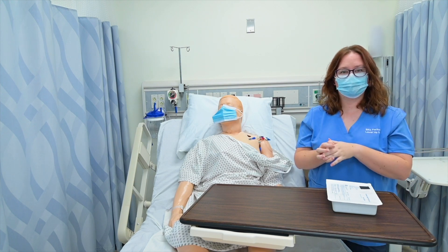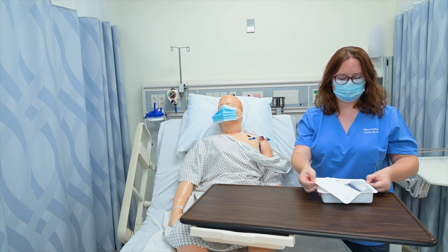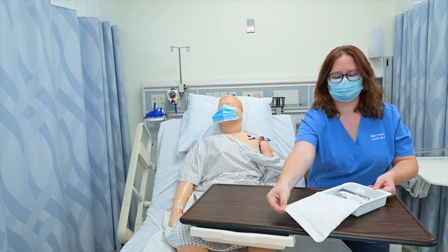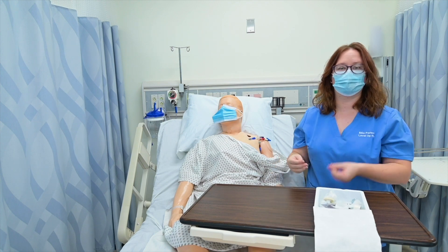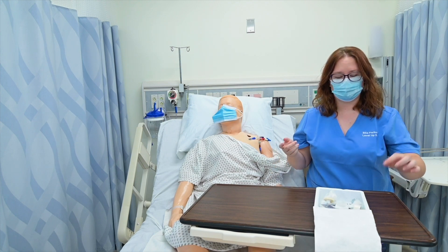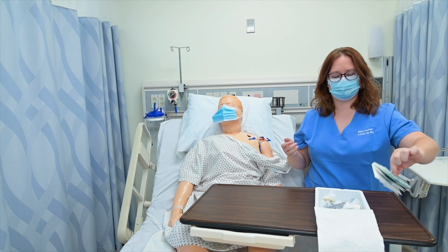Then I'm going to go ahead and set up my kit. I simply open my kit, and my first step will, of course, be to don sterile gloves. I'm going to grab the sterile gloves out of my kit.